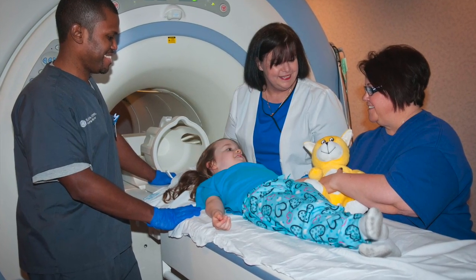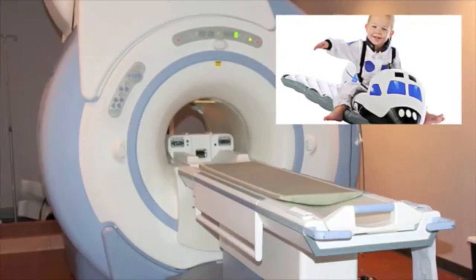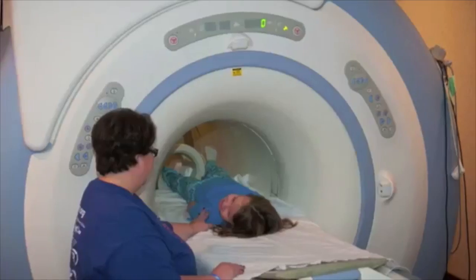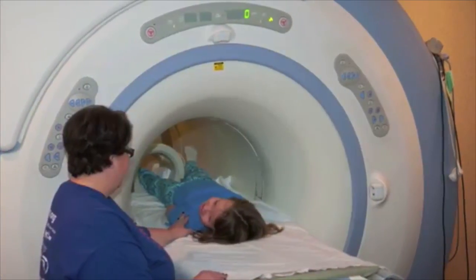The doctors use a camera called an MRI to take your pictures. I think it kind of looks like a spaceship. What does it look like to you? It never touches you, and you get to lie down inside of it while it takes your pictures.